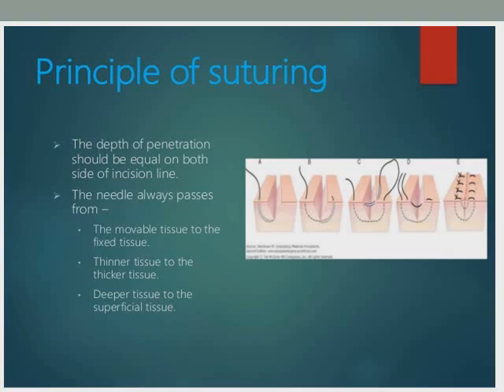Principle of suturing: the depth of penetration would be equal on both sides of incision line. The needle always passes from the movable tissue to the fixed tissue, thinner tissue to the thicker tissue, and deeper tissue to the superficial tissue.